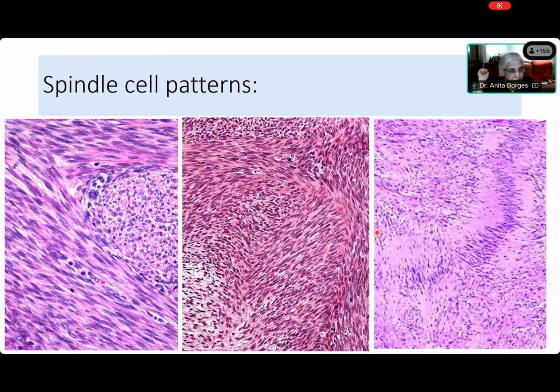Now we saw the first pattern over here, and we said what it was. What pattern is that, Saida? The one on the left? Ma'am, the first one is fascicular pattern. Yes, it's a fascicle. And can you define what is a fascicle, Saida? The cells are arranged in a slender bundle or a pine needle-like structure.